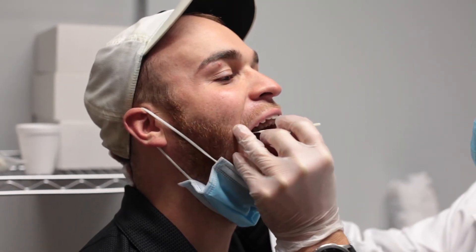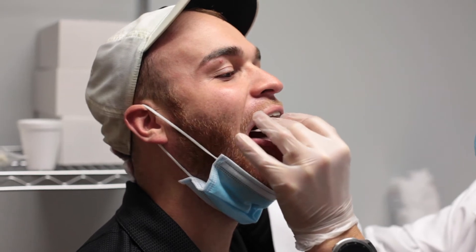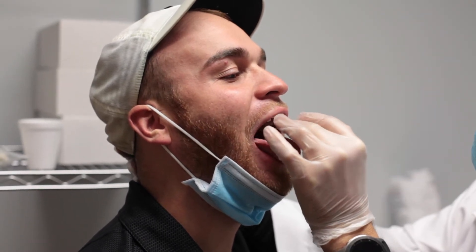Without touching the sides of the mouth, swab the back of the throat and the tonsillar arches. Avoid touching the tongue, teeth, and gums.